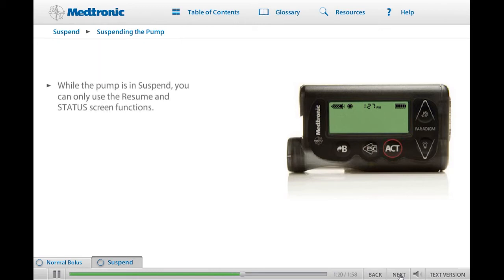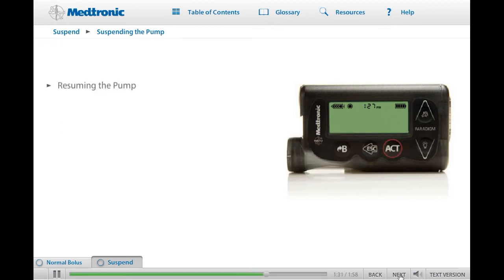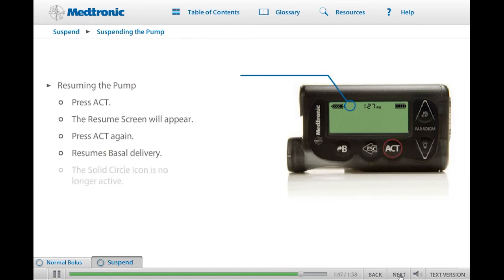The pump will also beep every 15 minutes on the quarter hour to remind you that the pump is in Suspend. When the pump is in Suspend, you cannot view any screen except the status screen. You must take the pump out of Suspend before you can perform any other function. To resume the pump, which restarts the basal delivery, press Act. The Resume screen will appear with the word Resume flashing. Press Act again. Your pump will beep once and resume delivering the basal rate as programmed. Notice that the solid circle icon is no longer displayed on the home screen. Practice suspending and restarting the basal insulin delivery on your pump. Click Next when you're ready to continue.